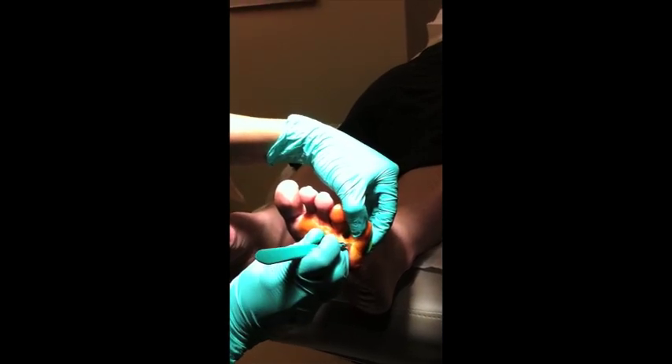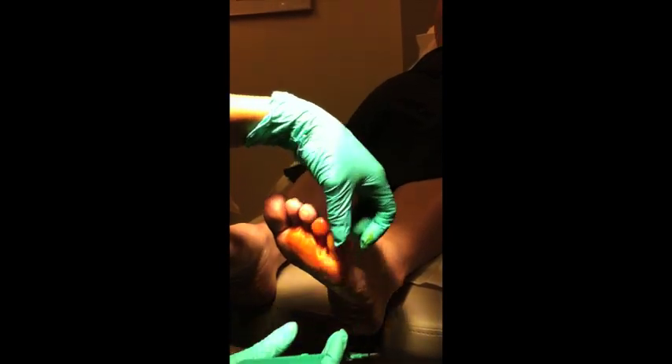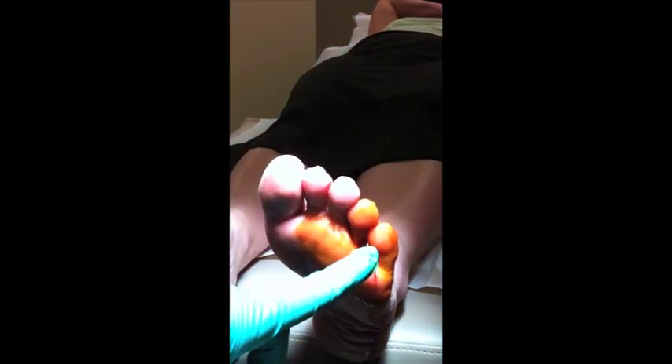It's a simple incision. And that's it. The procedure is over. Now Linda, if you could show us the difference between this curly toe over here, which we have not yet fixed, and this nice and straight toe over here.